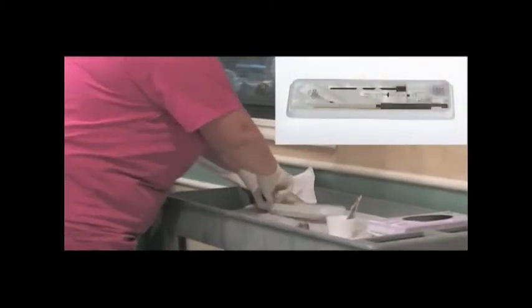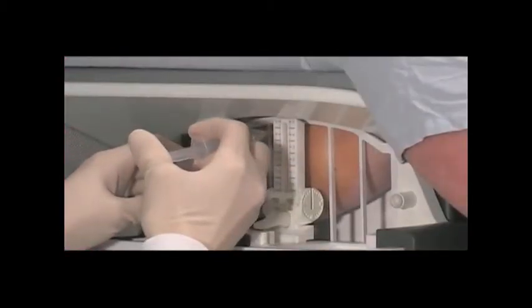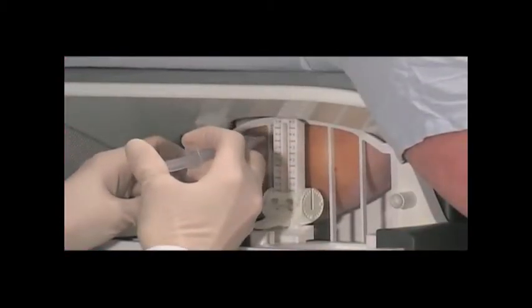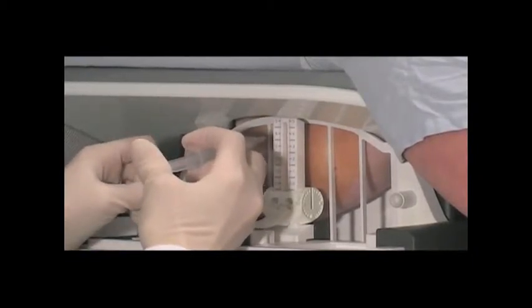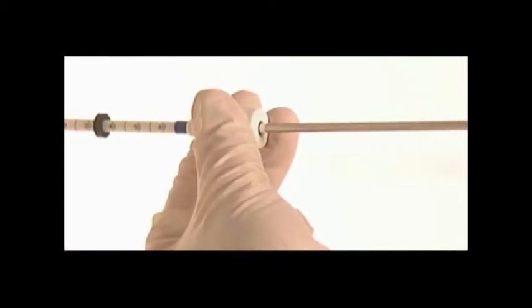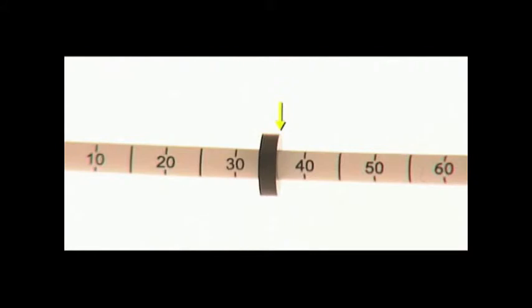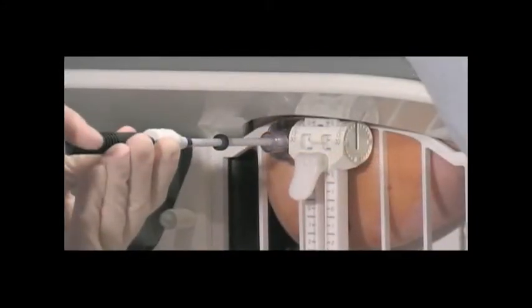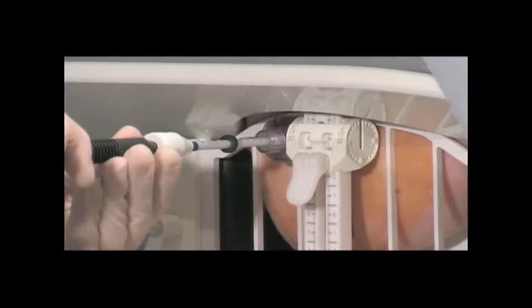Remove the contents of the introducer localization set. Using a sterile cleanser, swab the breast at the target biopsy site. Remove the fiducial from the turret for injection of the anesthetic at the area of interest. Place the introducer stylet into the needle hub assembly. Adjust the depth stop on the introducer sheath to the calculated depth, reading the depth from the side distal to the patient. Place the introducer sheath and stylet into the needle hub assembly.